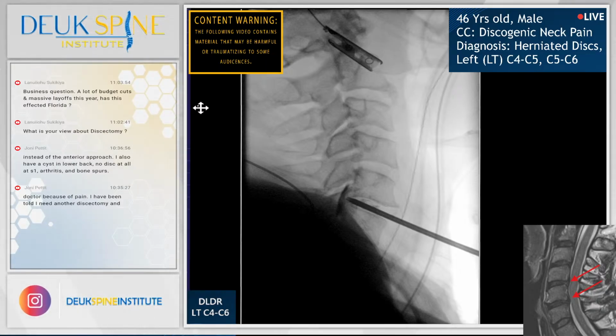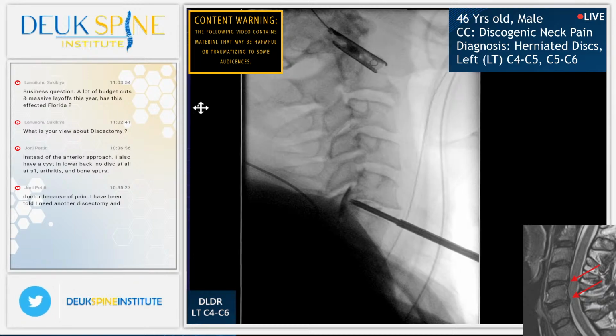Any questions? As of right now, no current questions. Again, this is C5-6. Next will be C4-5. We're going to fix 5-6 first. Can you give me a little inline shot? I've got it. All right.